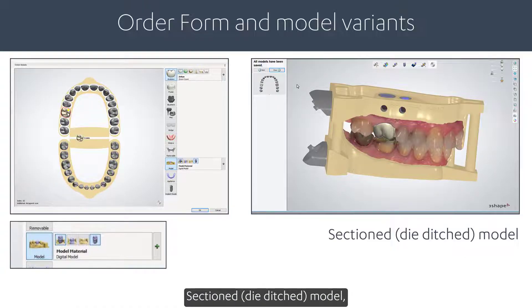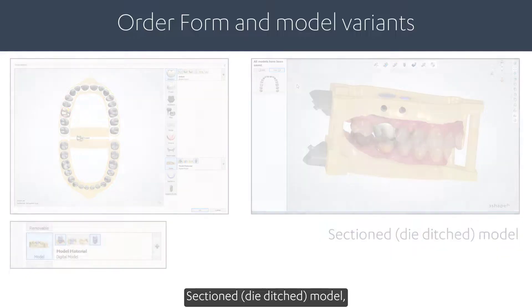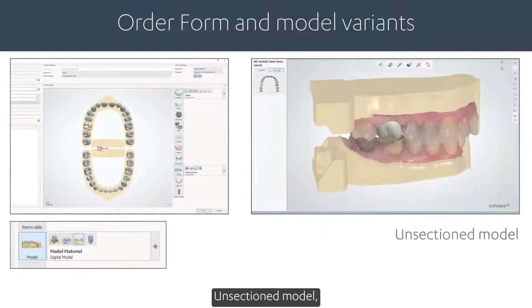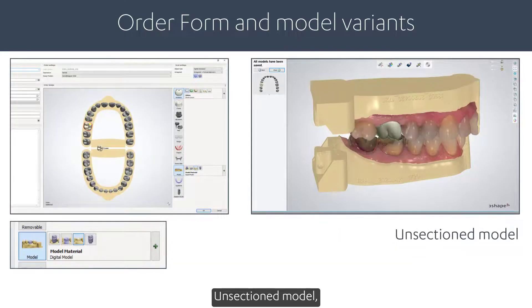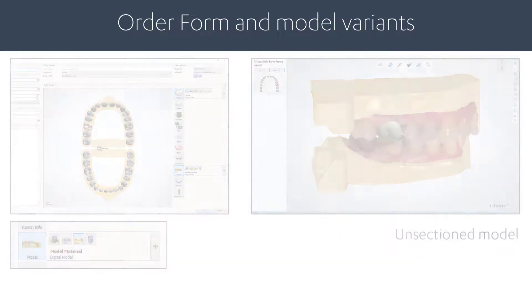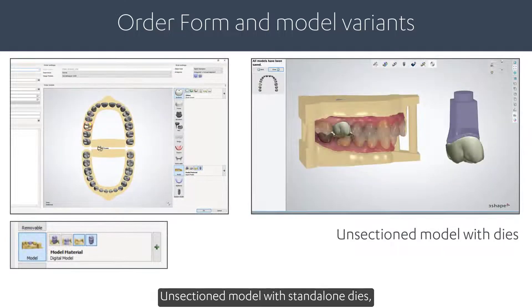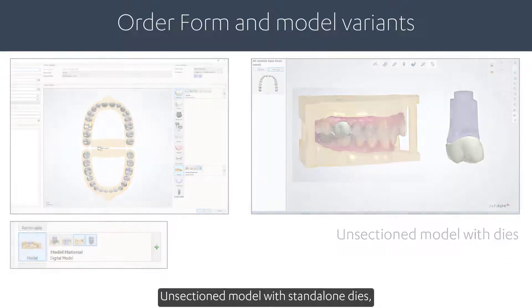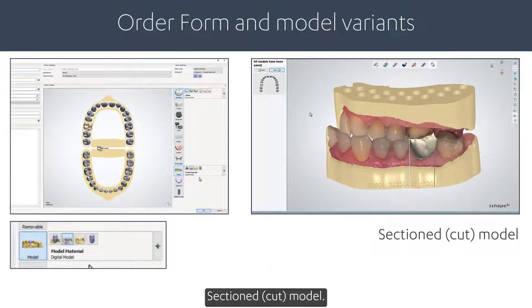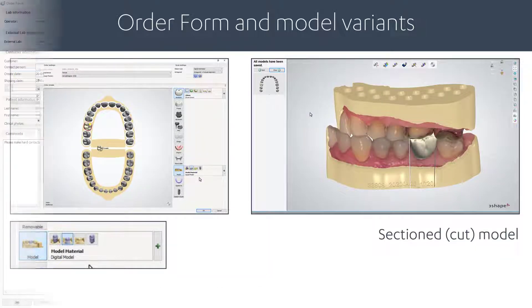The available model variants are: Sectioned die-ditched model, Unsectioned model, Unsectioned model with stand-alone dies, and Sectioned cut model.